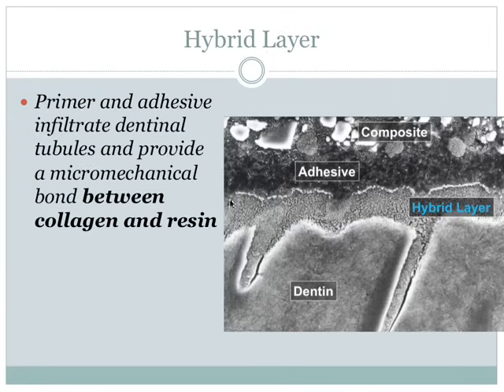And what happens is once you etch, here's dentin for example, it leaves these little micromechanical lock features so that when you place the adhesive, it can link into these spaces and form the hybrid layer so that the composite can bond via the adhesive layer to tooth structure.